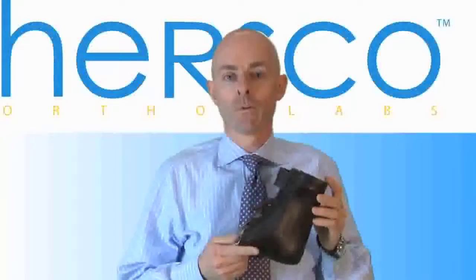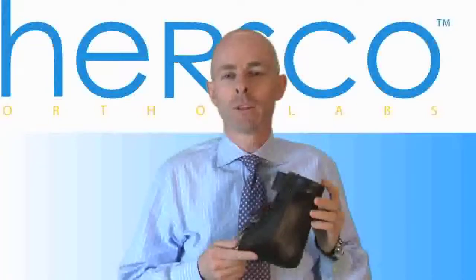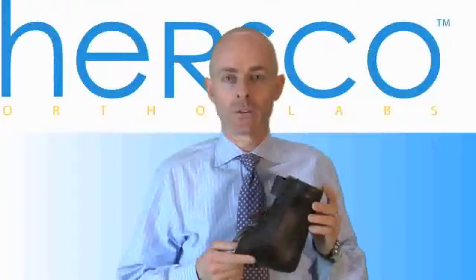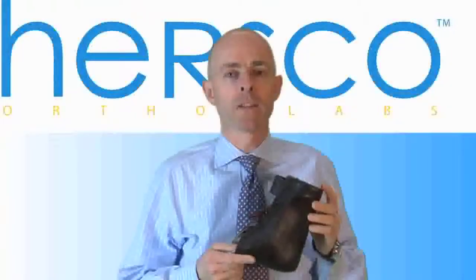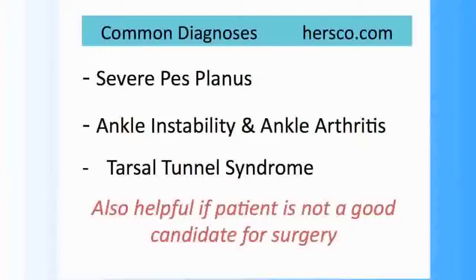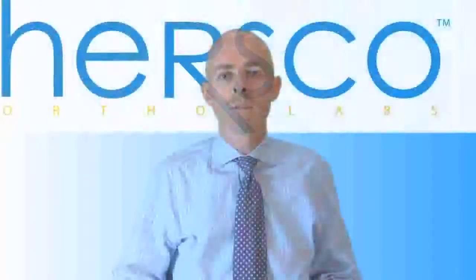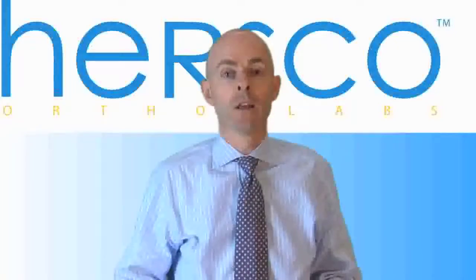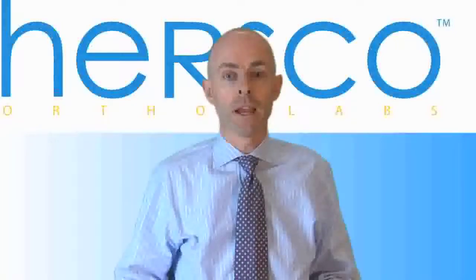They give excellent control for certain cases, the primary diagnosis being PTTD, or posterior tibial tendon dysfunction. They're also excellent for severe pes planus, where there's a complete midfoot collapse. They're great for cases of ankle arthritis and also for tarsal tunnel. Sometimes they're used in cases where the patient is not a good surgical candidate, but they need to control the motion of the ankle.